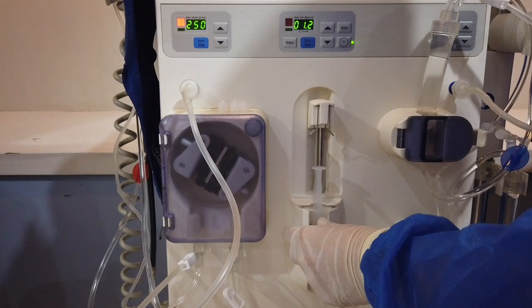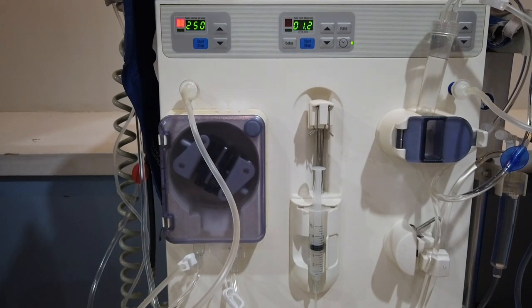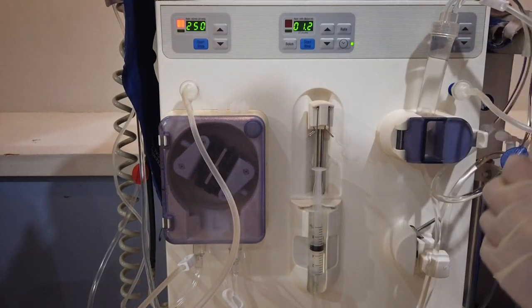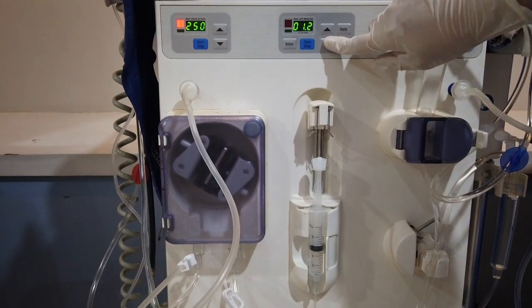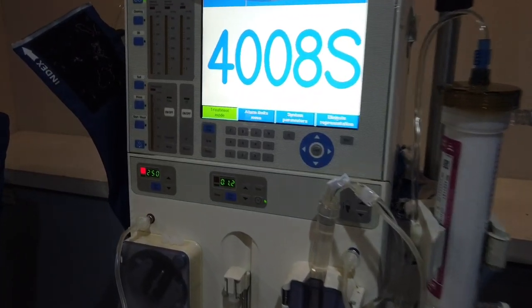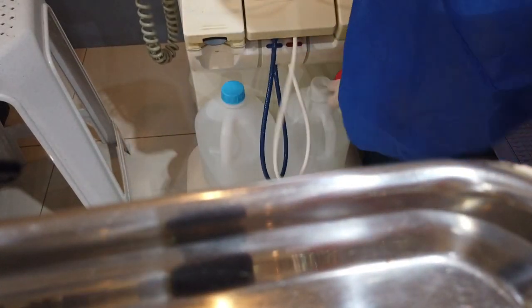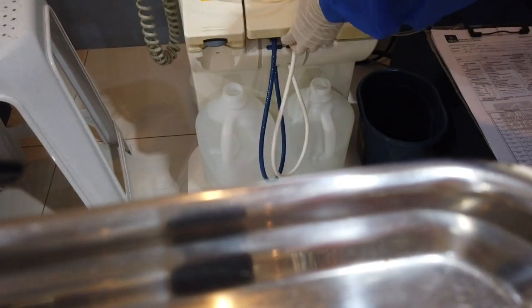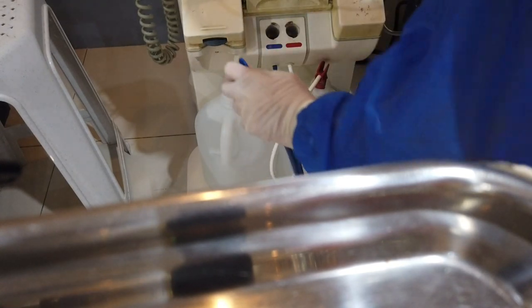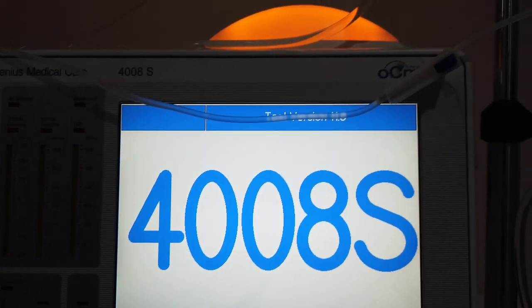The heparin syringe pump ideally holds a 20cc syringe, but since I'm using a 10cc syringe, I need to tape it to prevent it from falling and put something on top of the plunger for a secure fit. Press the down button to lower the syringe pump plunger and securely attach to the 10cc syringe. Once the disinfection is complete, the machine will alarm and display the 4008S screen. Make sure the bicarbonate and acetic acid solution are available. Then connect the concentrate connectors to its corresponding solutions, blue to bicarbonate while red for acetic acid. Press the test button to start T1 testing.